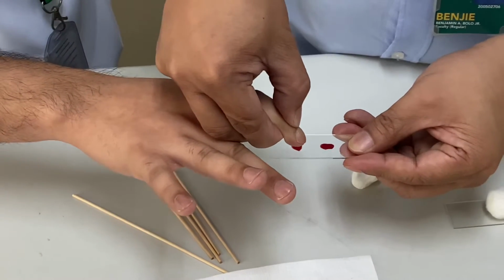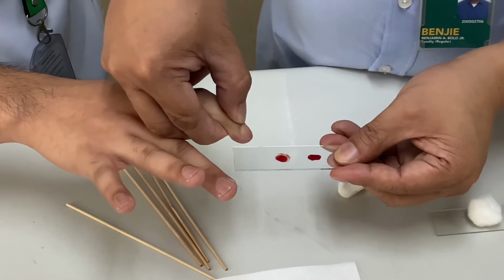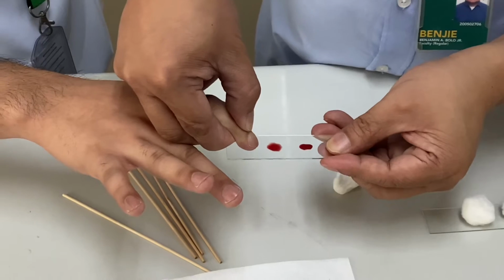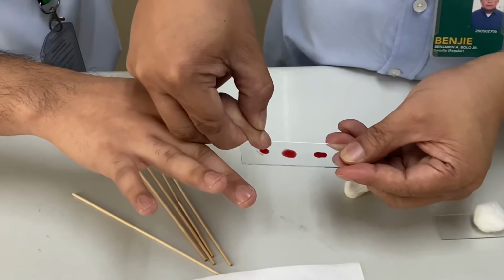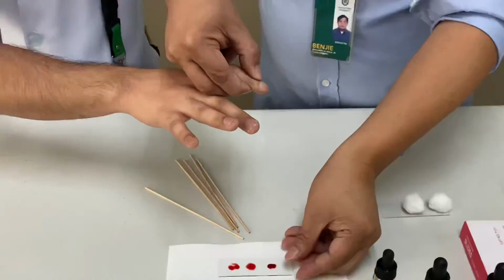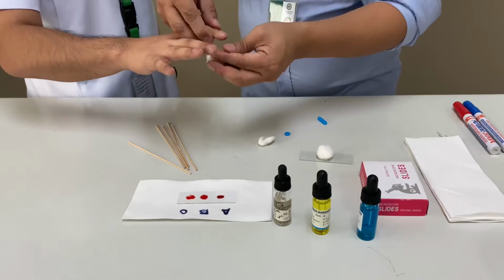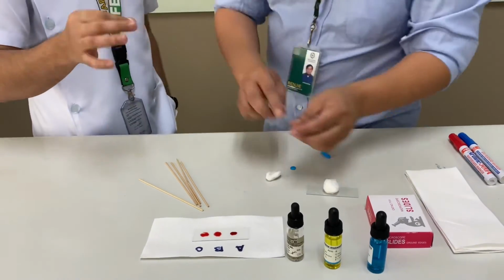the blood sample will be distributed into 3 places in order for us to use the 3 types of anti-sera. Okay, so you're good.